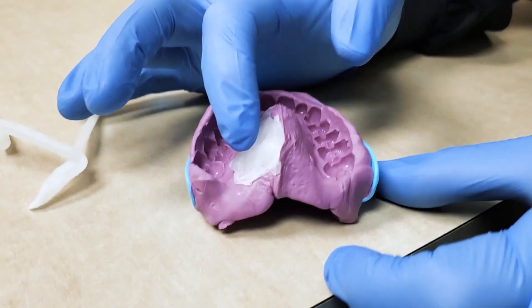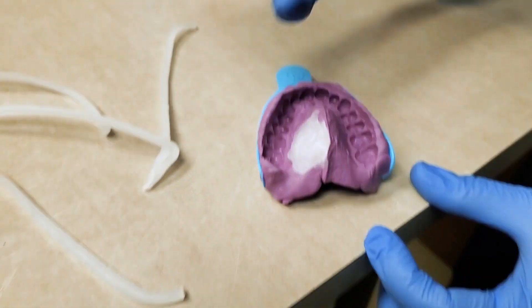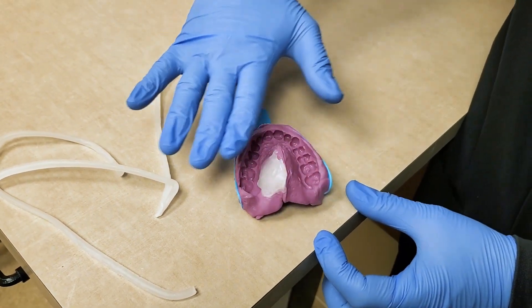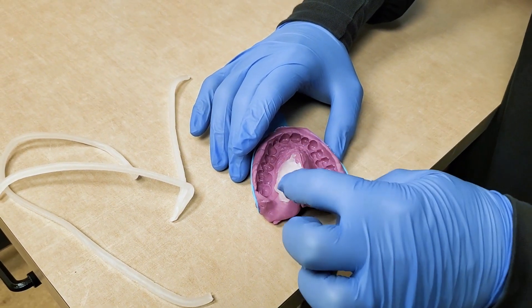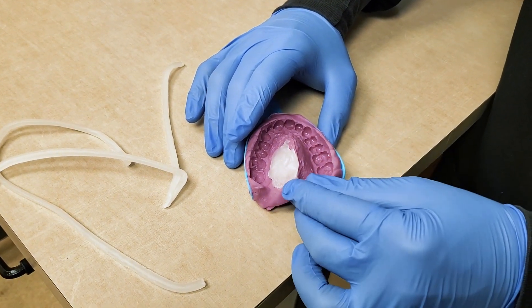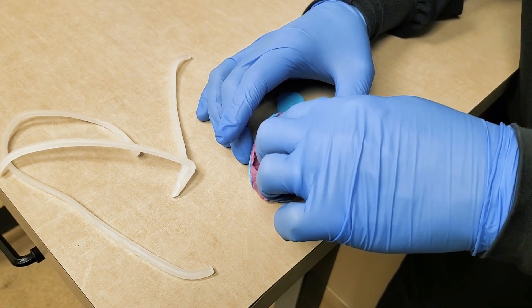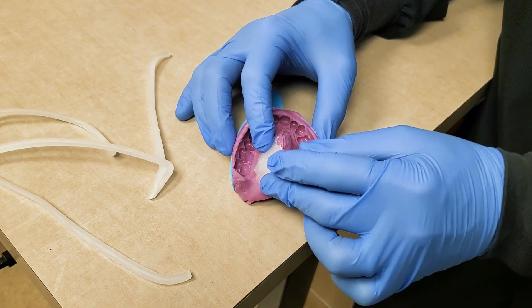When the stone model is made, it's going to look pretty much like the opposite side, so that we don't have a bump on that stone model. Then when we make a plastic matrix, it will sit over top and fill in that void at the time when we remove the entire lesion. For today, what we did was an incisional biopsy where we took a portion of it away.